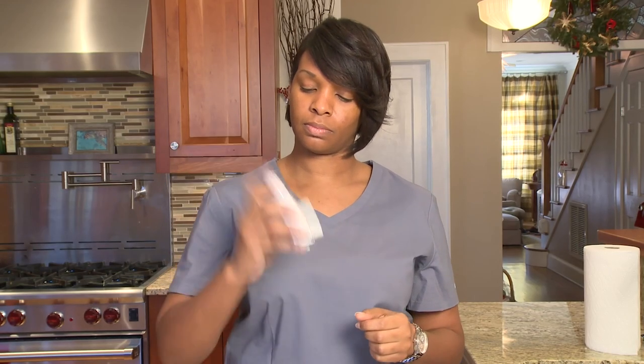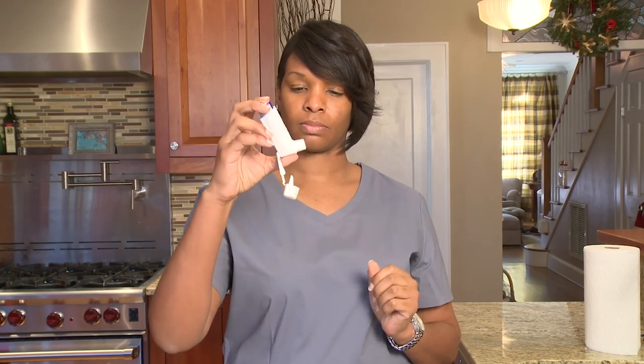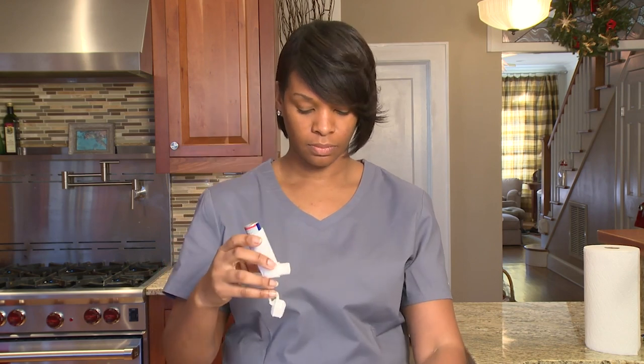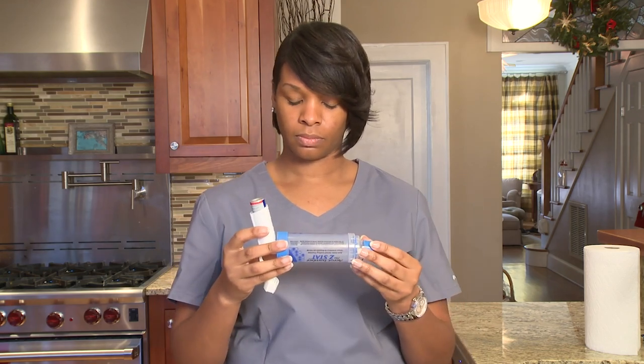Most MDIs need to be primed or prepared when first used. You prepare it by squeezing the MDI top and bottom two times into the air. If you don't use your MDI for two weeks or more, you should prepare it before you use it.